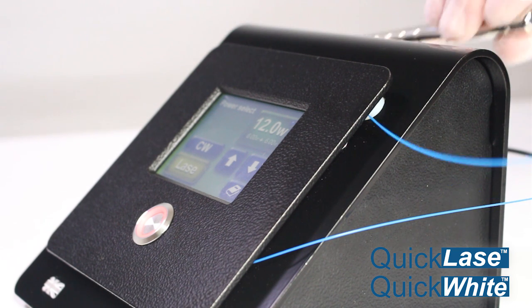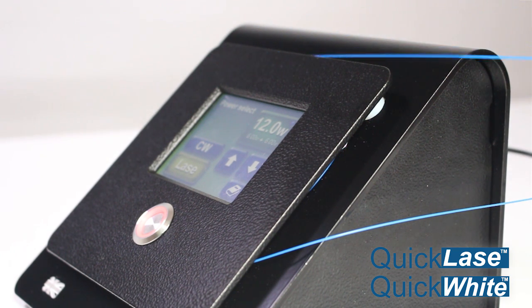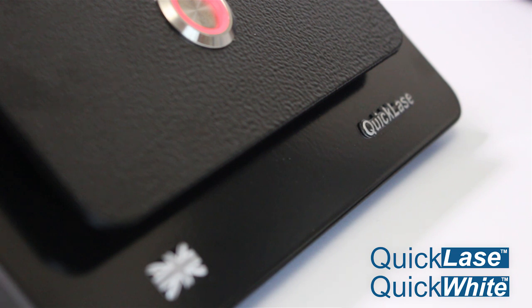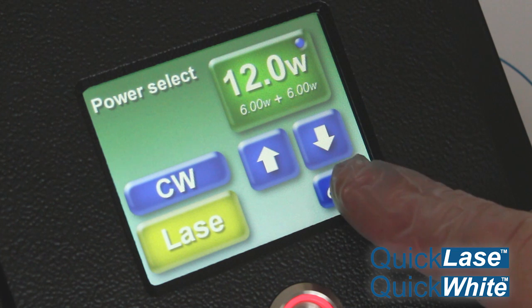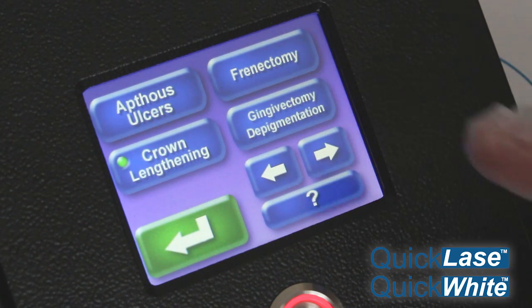What makes the QuickLays lasers unique is the built-in Fiber Caddy, durable aluminium case with 100% EMC protection. All models have colour-coded screens, allowing for ease of use.